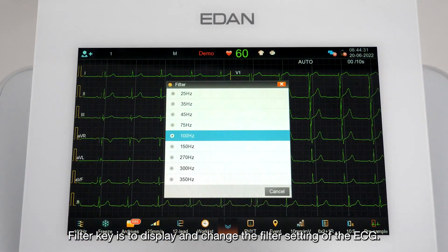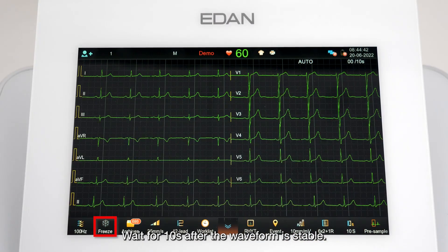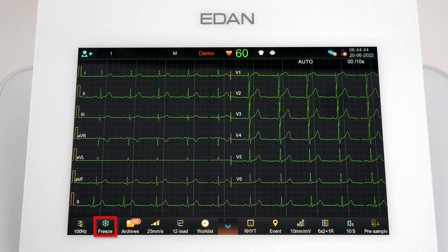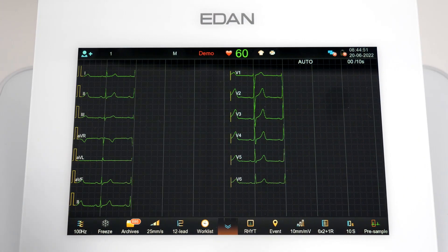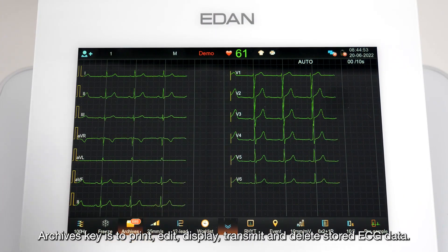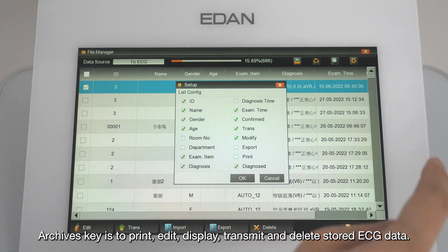The Filter key displays and changes the filter setting of the ECG. Wait 10 seconds after the waveform is stable, then click the Freeze key to freeze the waveform screen. The Archives key is used to print, edit, display, transmit, and delete stored ECG data.